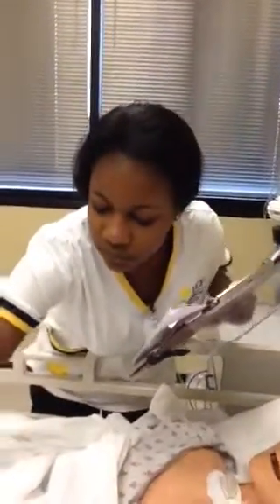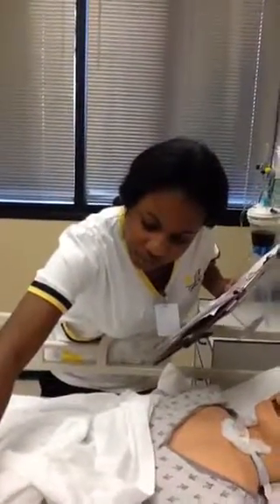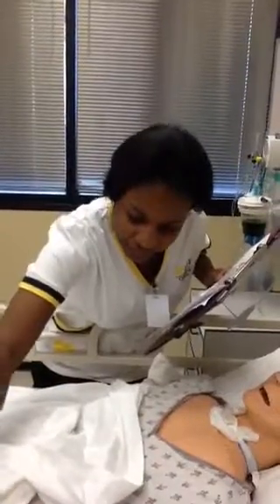Knock knock. Hi, my name is Winnie. I will be your student nurse for today. I understand that the doctor ordered a Foley catheter for you. Can you identify your name and your date of birth for me? Charles Knight, 08/08/1939. Allergies to penicillin, betadine, latex.